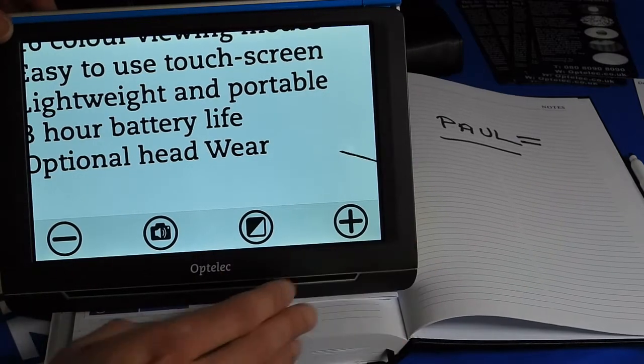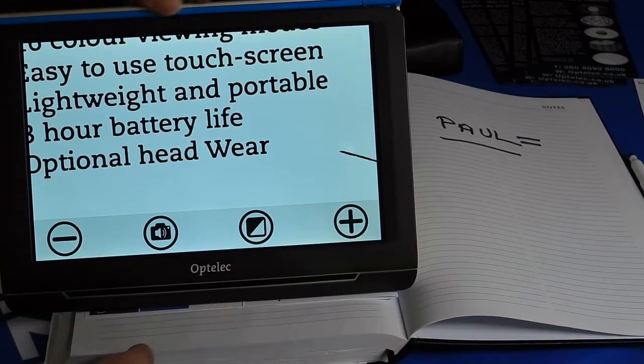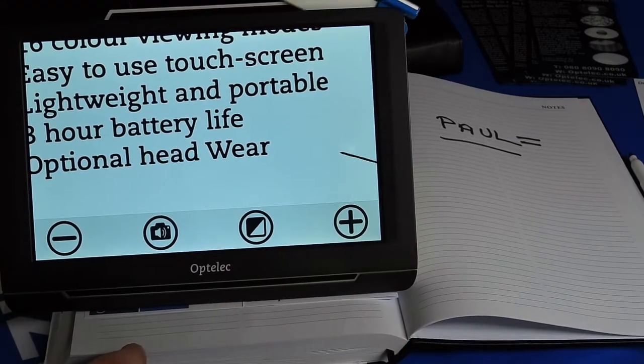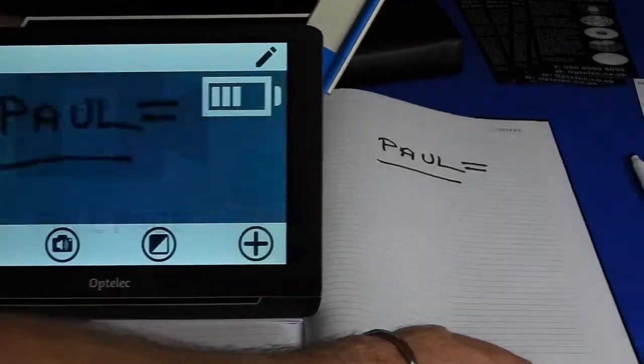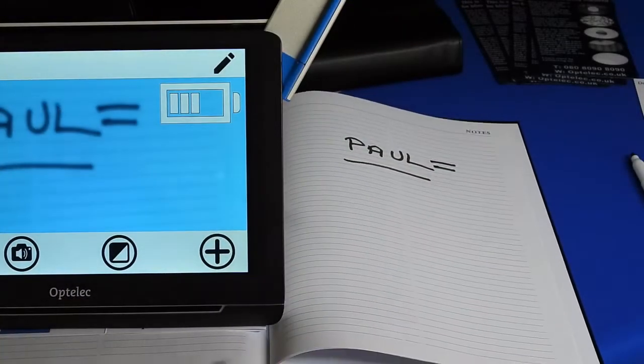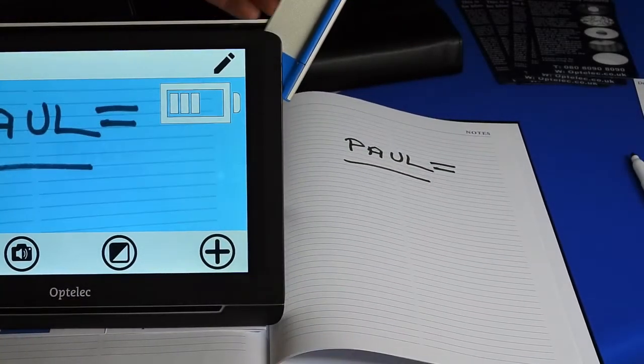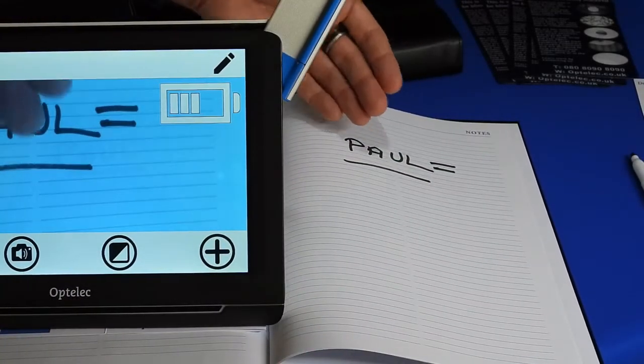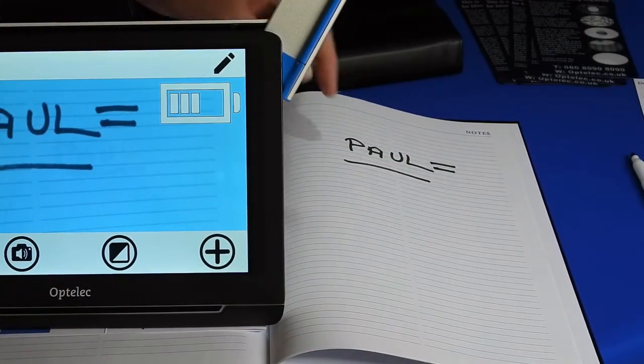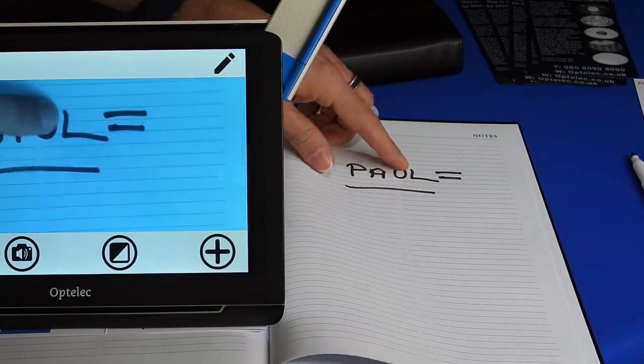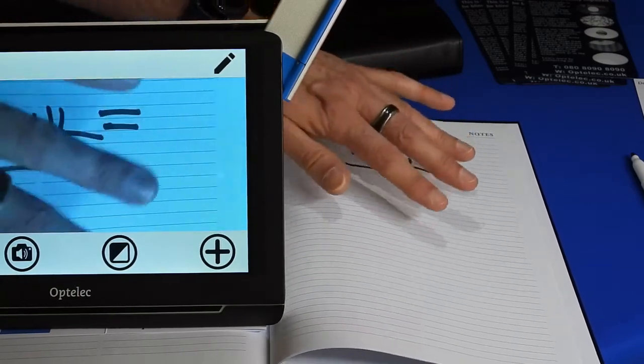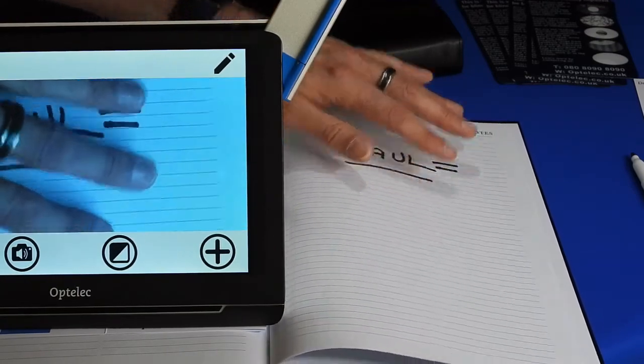By lifting the camera arm, we now are able to use the secondary camera to read text to the right of the machine.